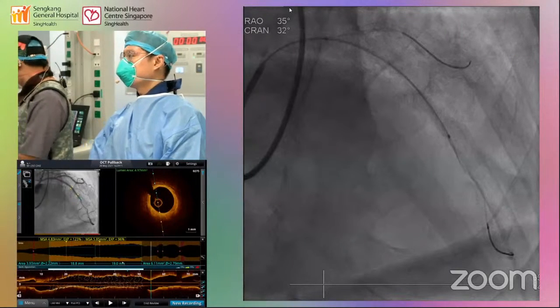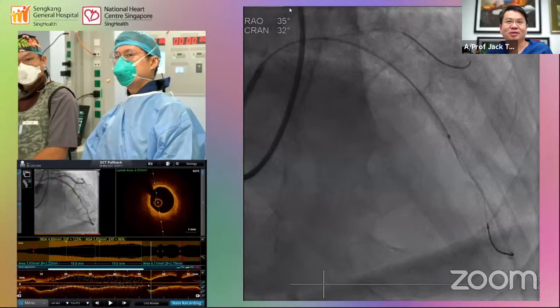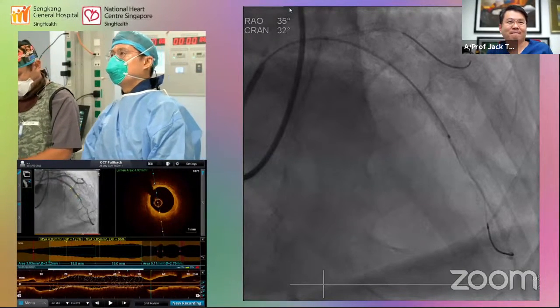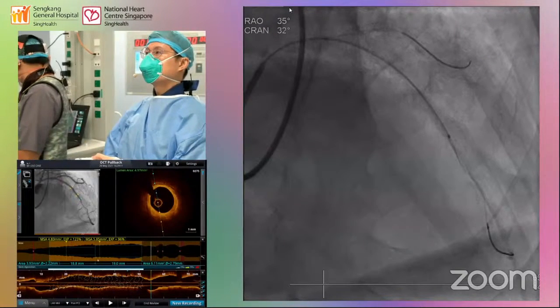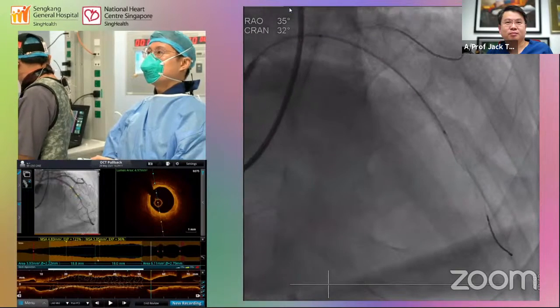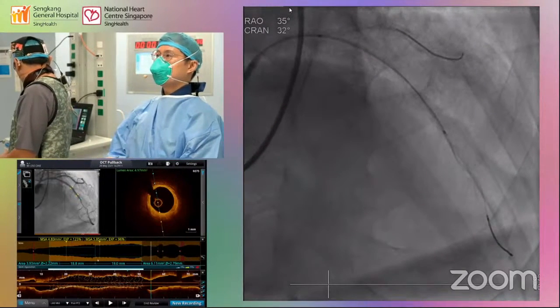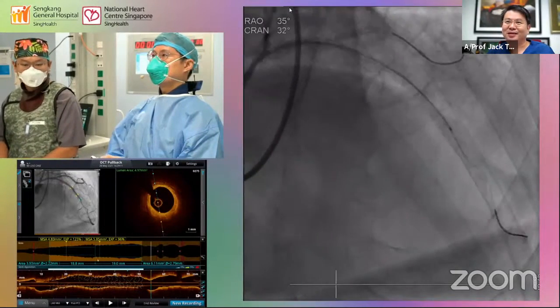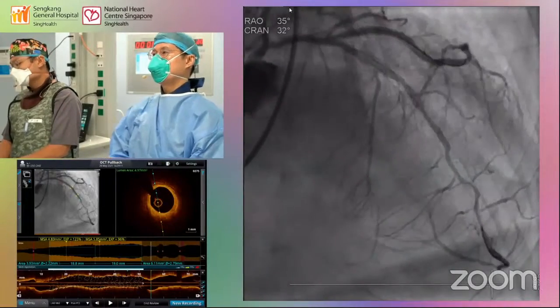Yeah, we're back. You want to show? You're there, so we can see you, and maybe you'd like to tell us what you did ultimately. Jiaming, we're all eager to hear you. Yeah, thanks, Jack. Are you able to see the angio clip now? Yep, maybe you can play. So this is the last time we left you. This is after the OCT run. So you have 5 minutes to show us what you have. Yeah, so this is to show you the angio clip after the shockwave.